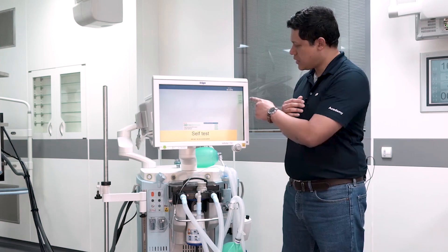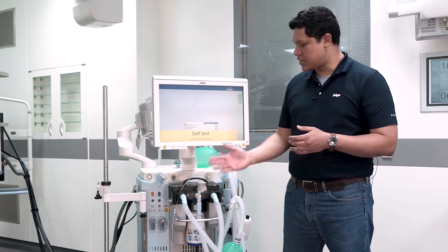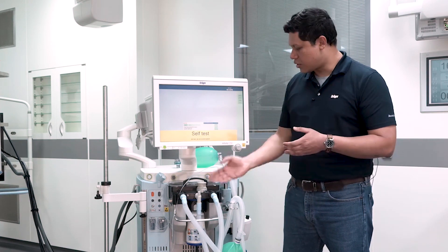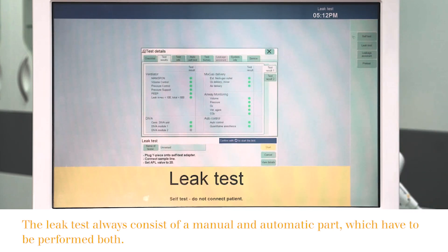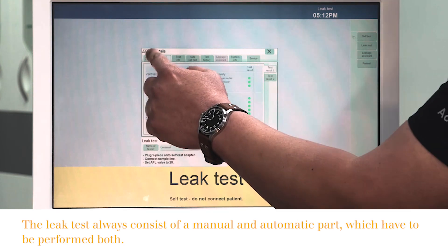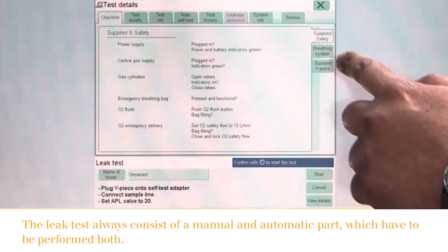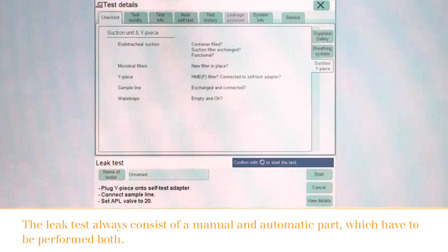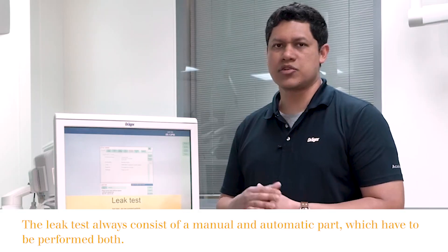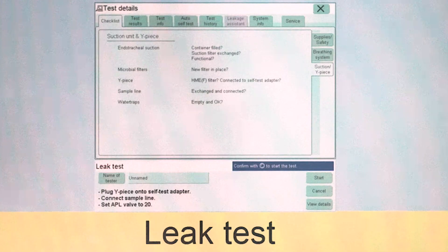The second test that you can perform is the leak test. This one should be performed between patients once you have exchanged the breathing hose system, the soda lime canister, or the water trap. Here you press on the leak test button and you will be displayed with the same checklist we just reviewed for the self-test — supply and safety components, breathing system components, and suction and Y-piece systems. Once you have gone through the complete checklist, you just press start to continue with the leakage test.